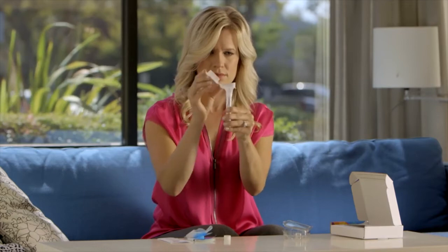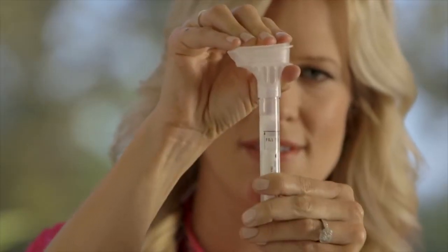To release the buffer solution, fold the funnel lid over and close it slowly until you hear a snap. Then carefully unscrew the funnel lid and replace it with the tube cap, making sure it's on tight.